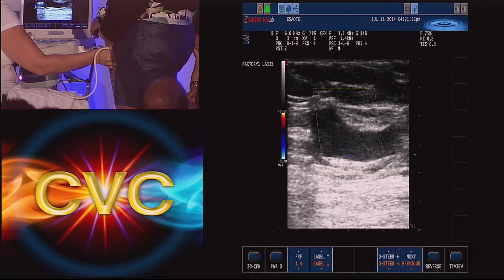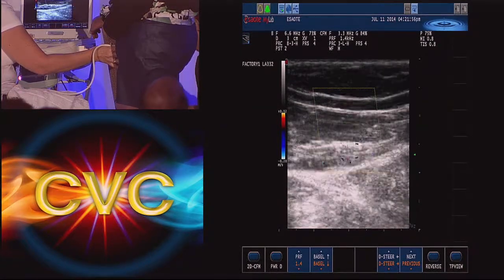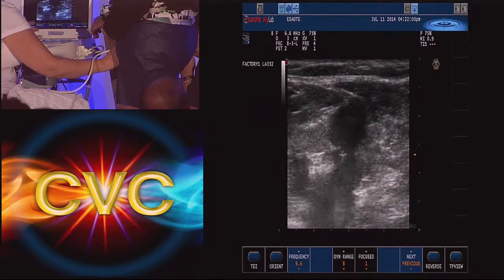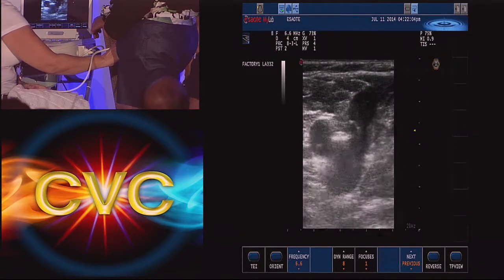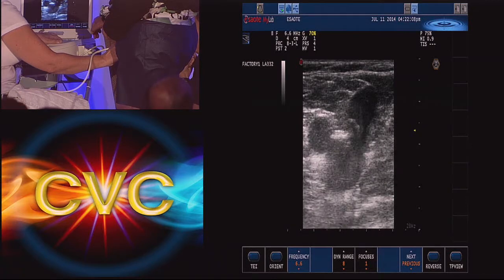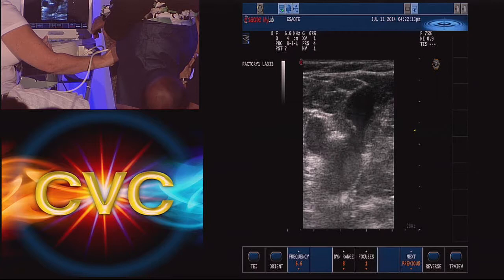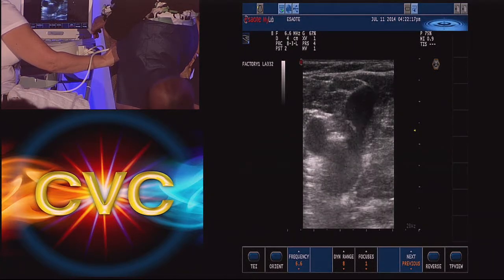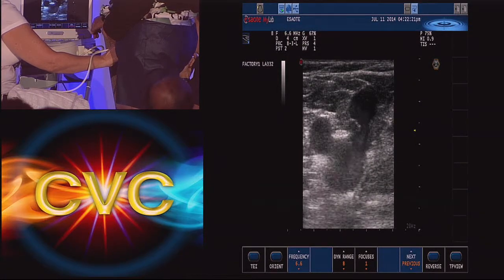And now we trace this right back up further into the saphenofemoral junction. You must know where the common femoral vein is, because that's the one thing you never want to shut down. I call it the edge of the cliff. I know there's an edge here. I'm not going to go over it. So in this case, I have to stay behind that. We do this every day when we are driving. We know where the wrong side of the road is, so you drive within the lines. See, the artery's pulsating. Can you measure the width of the saphenous there at the junction?